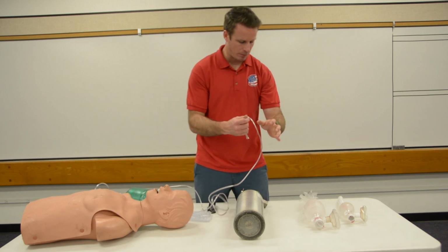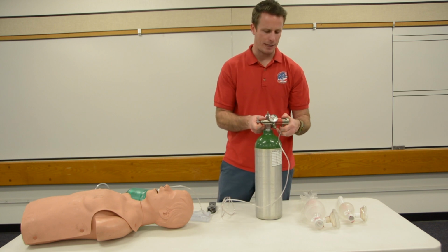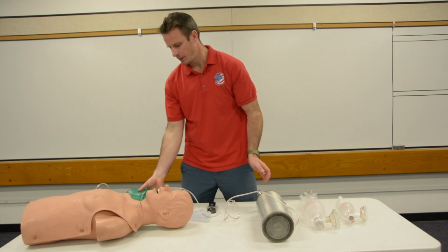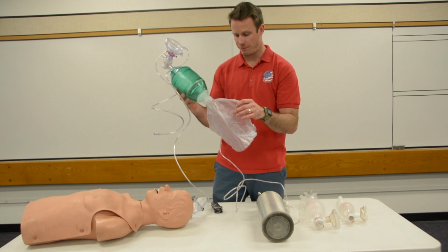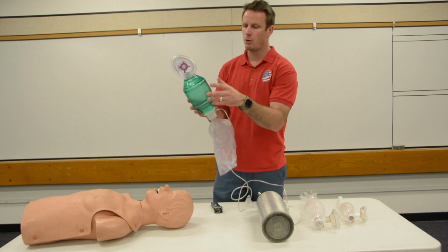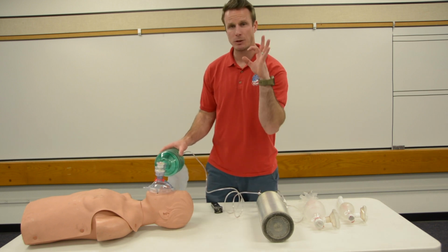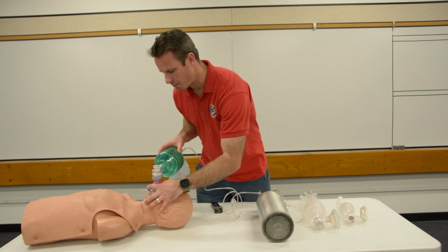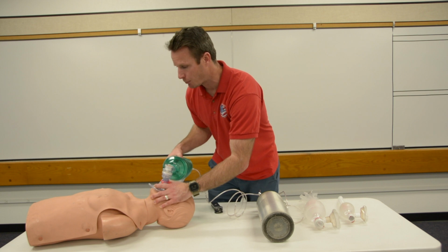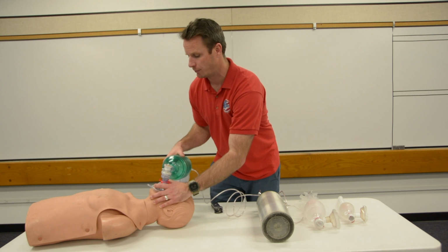I'm going to attach it to oxygen. My flow rate for my bag valve mask is actually going to be 15 liters per minute. So I'm going to turn that up to 15 and lay it back down. And I'm going to make sure that my reservoir bag fills prior to putting this on the patient's face. So once I have my oxygen all ready to go, I'm going to put this over my patient's nose. I'm going to use a CE grip to get a good mask seal. And I'm going to do a nice head tilt chin lift to open up that patient's airway. And I'm going to breathe for this patient one breath every 5 to 6 seconds if they're not breathing well on their own.